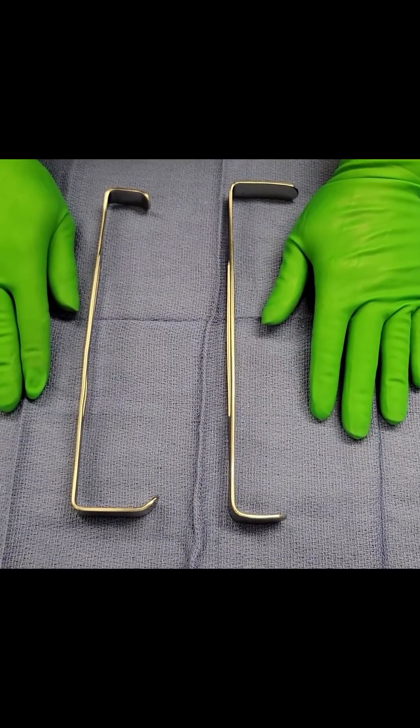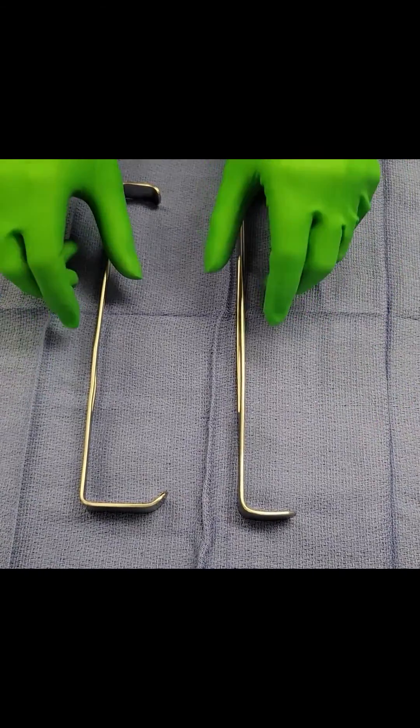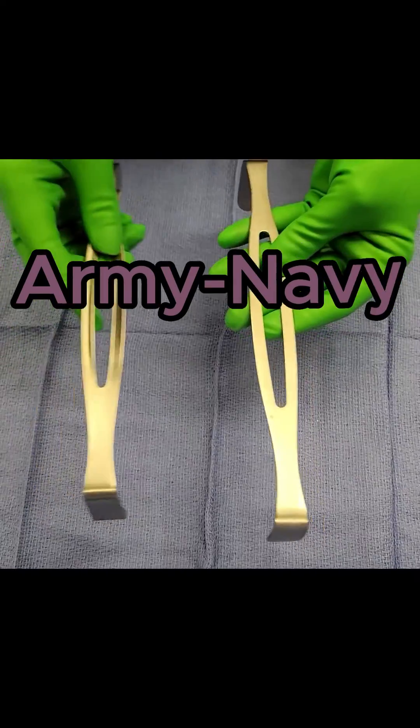Welcome to another segment of Surgical Instrument of the Week. This week we'll be talking about the Army-Navy retractor.